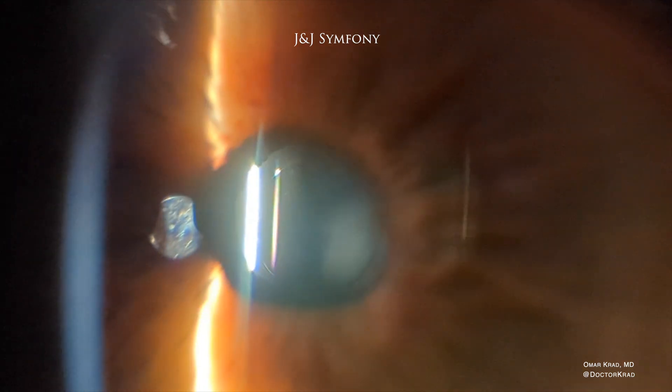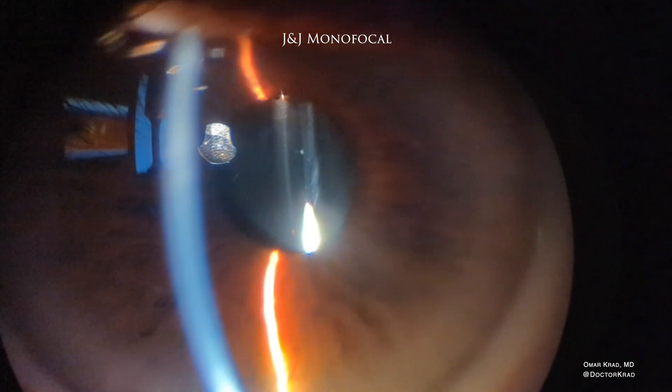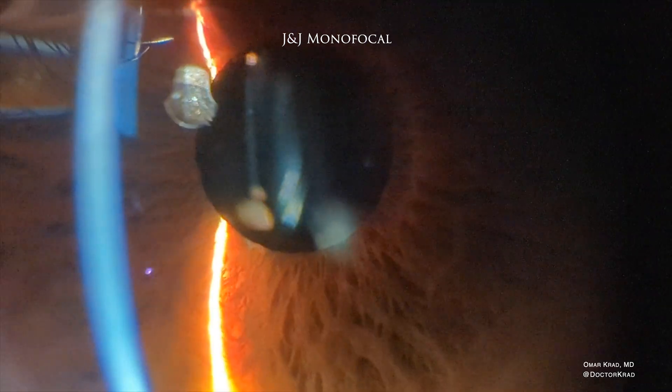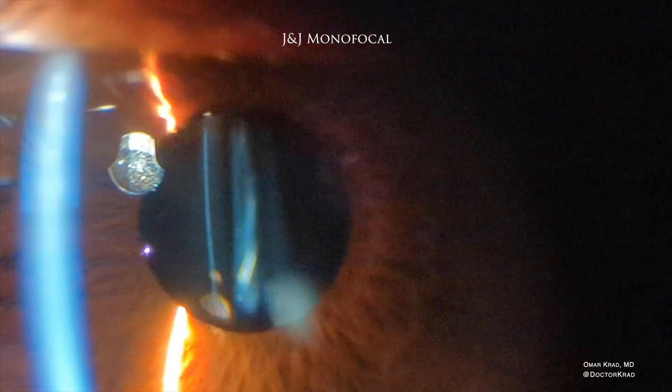This lens implant is not injection molded; it is lathe cut. Here you have another J&J lens implant, a monofocal implanted about 10 years ago, that also looks perfect — no glistenings. The lens implant looks brand new, like it was implanted this past week. A great job by J&J in terms of material and manufacturing.